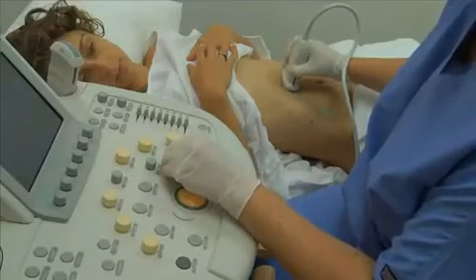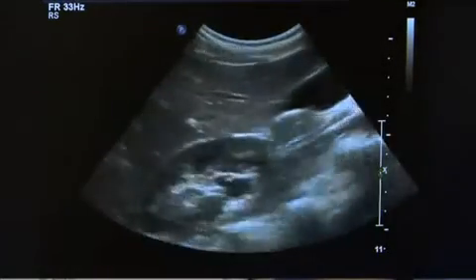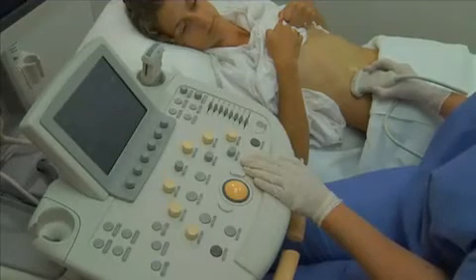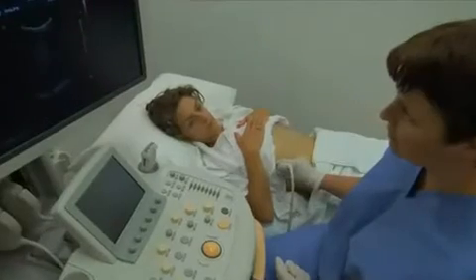Perform a survey of the abdomen and make any necessary adjustments to the machine's settings to maximize the image quality. Once the survey is complete, begin the liver scan. The most useful positions for liver imaging include the right subcostal and intercostal approaches.